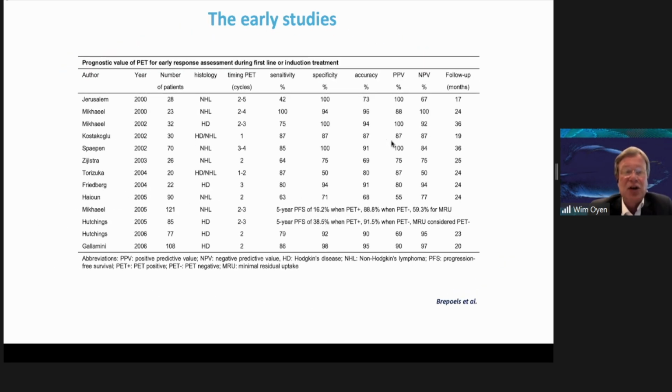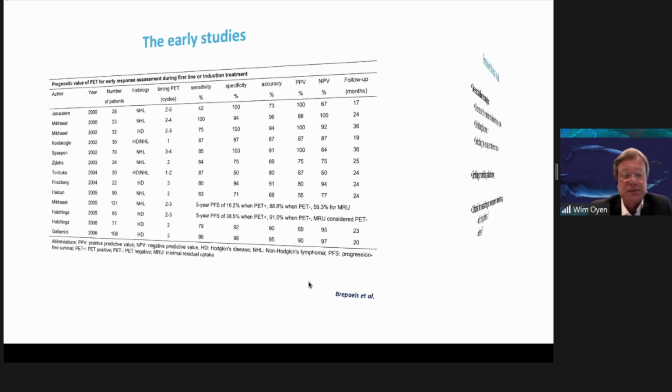And there's a lot of literature on the use of PET in treatment response for lymphoma. This is a summary of some of the early work, which was generally heterogeneous populations, in part retrospective, with no PET-induced change in therapy. But this set the stage for the interest of thoroughly exploring what FDG-PET-CT could do to assess response.